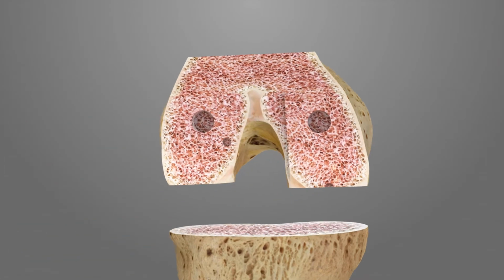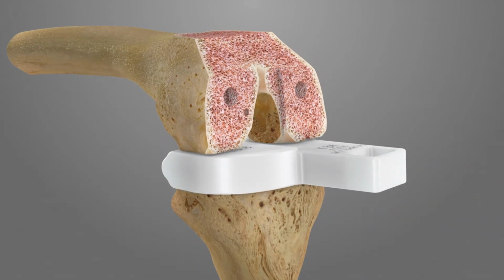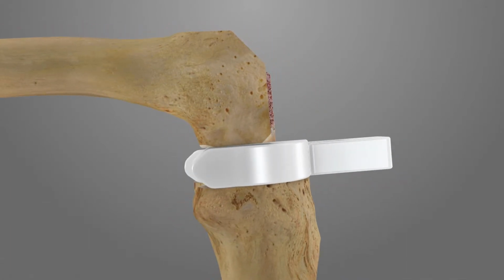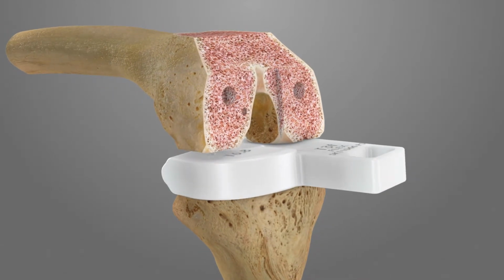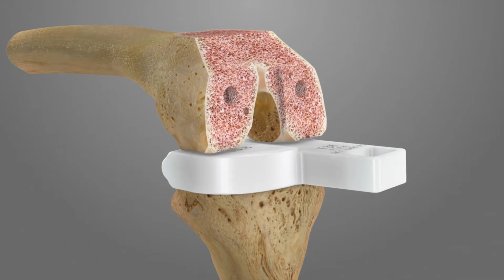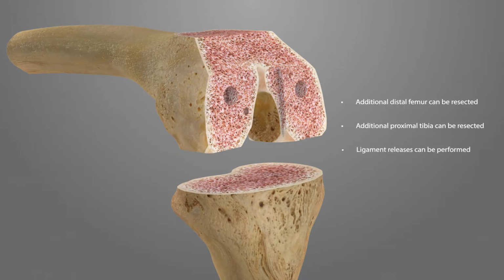With the knee in 90 degrees of flexion, insert the post-resection flexion spacer iJig, T3F, on the cut tibial plateau. The femoral condyles should sit posteriorly on the T3F iJig. Reconfirm assessment of appropriate balance by applying a varus and valgus stress. The shims can be used on the surface of the T3F iJig to assess laxity of the flexion gap. If the knee is appropriately balanced and aligned, proceed to the remaining steps of final femoral preparation. If the knee is tight or loose in flexion, resect additional distal femur or proximal tibia, or perform ligament releases.